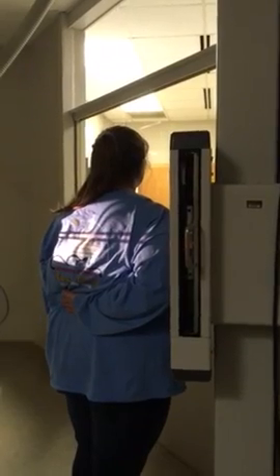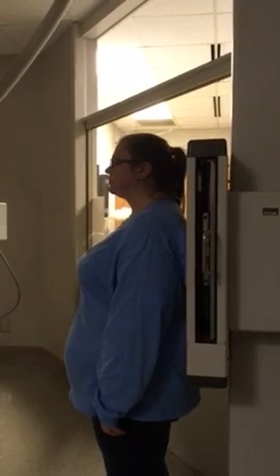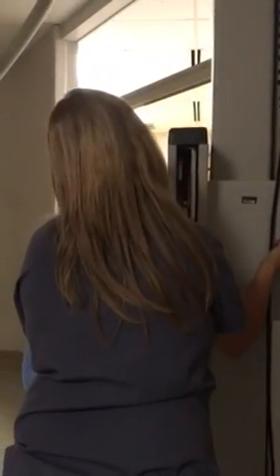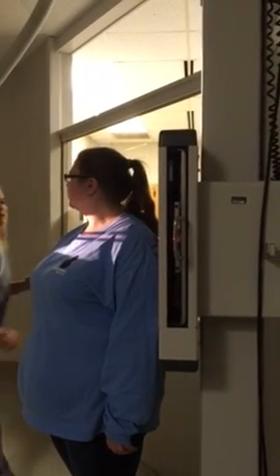Oblique, that's the Grashey. Let's come this way. For those who are at Grenada, all they're gonna want you to do is rotate the patient towards the hurt side. And you're gonna open up the glenoid.